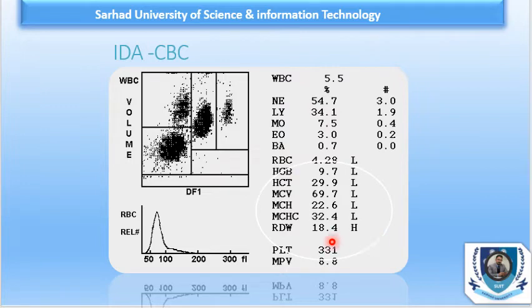So you will make a peripheral slide, and then you will focus on it and look for cells that are microcytic. If there is some abnormality in the peripheral smear, you must see microcytic cells. These microcytic cells will be hypochromic as well. And in iron deficiency anemia we have some elliptical cells, pencil cells.